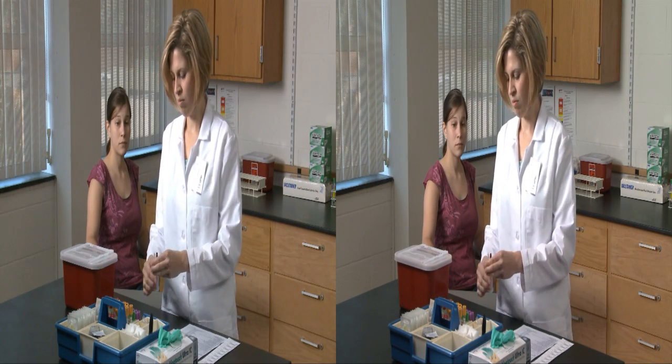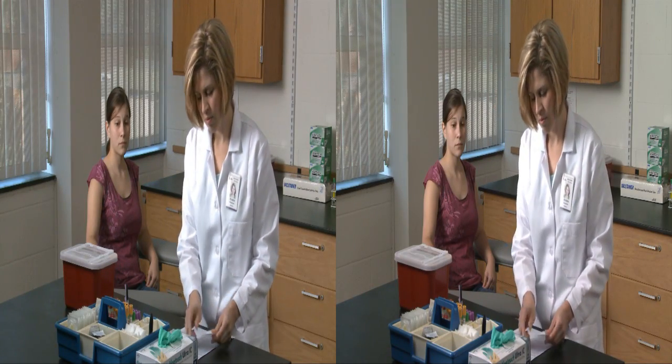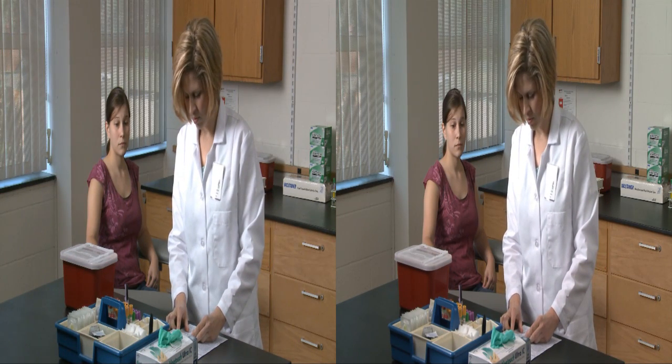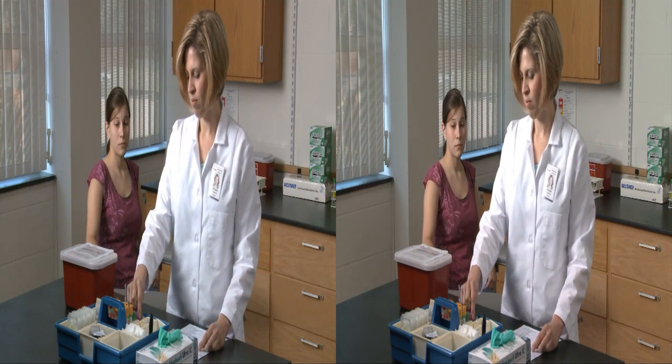The first step is to accurately ID the patient using at least two forms of identification. Does the name and date of birth on the requisition form match what the patient is telling you? Does it match what is on the patient ID wristband? Has the patient followed special orders, such as fasting prior to blood draw?